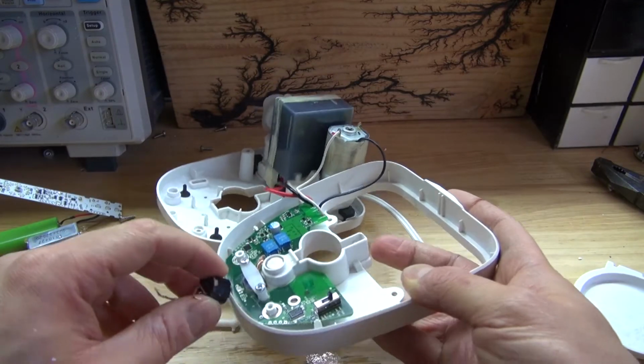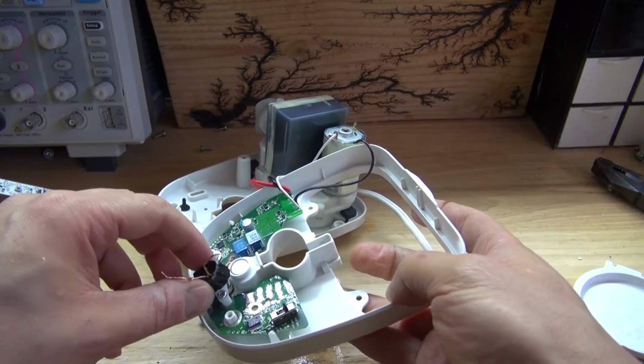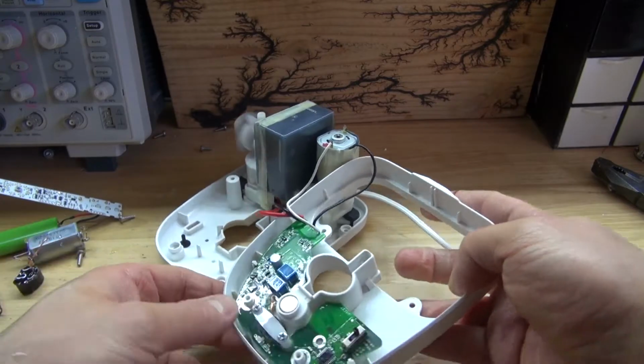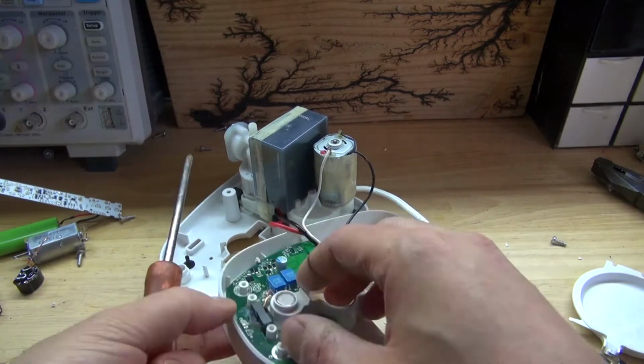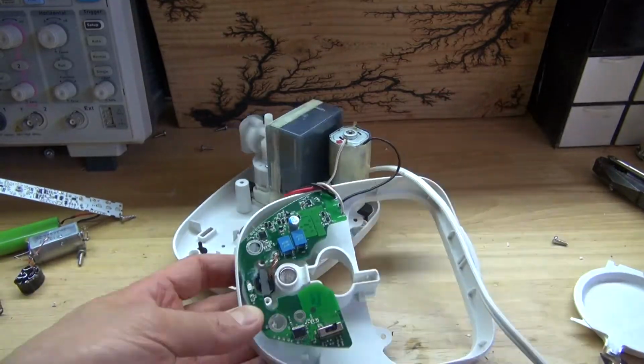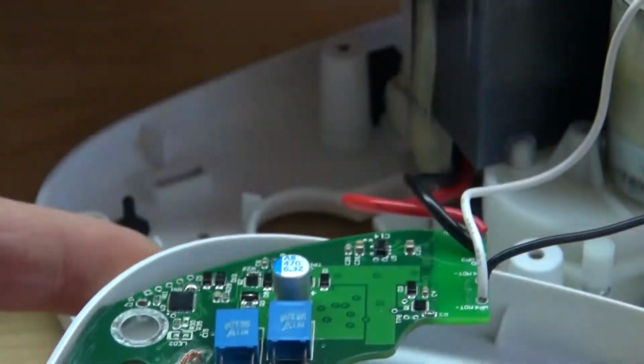Interesting. So it's definitely a transformer with two parts. Of course, it makes sense. If you put the two parts together, it creates the electromagnetic field, allowing the input voltage from the primary coil to transfer into the secondary coil, which powers the device. Therefore, in this device, it recharges the battery, allowing the toothbrush to work.